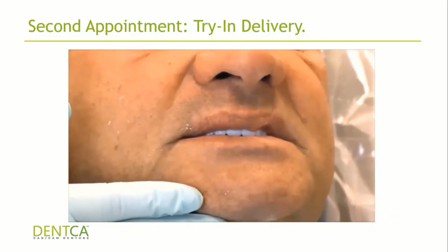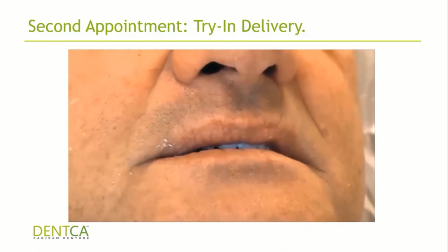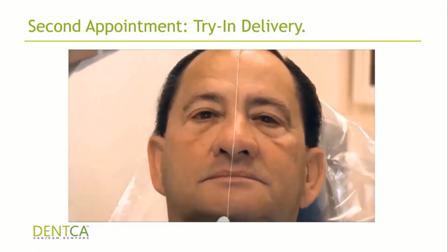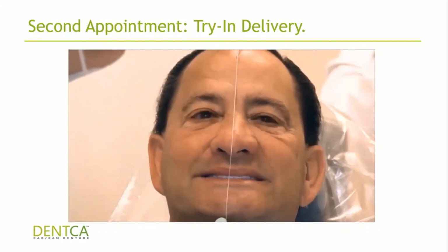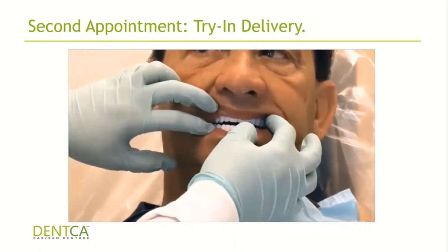They check the upper lip length, they check the midline, they make sure the patient is satisfied with everything. And in this case, they're using dental floss to determine whether the midline is aligned the way they want it or not. And that way they can determine that. And then they're going to check the bite.